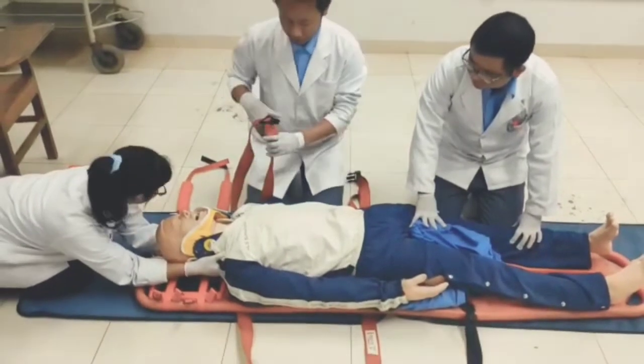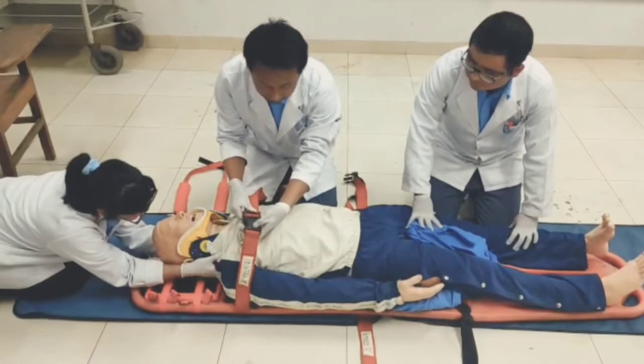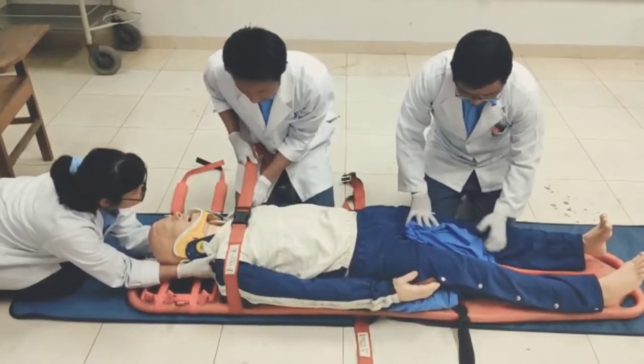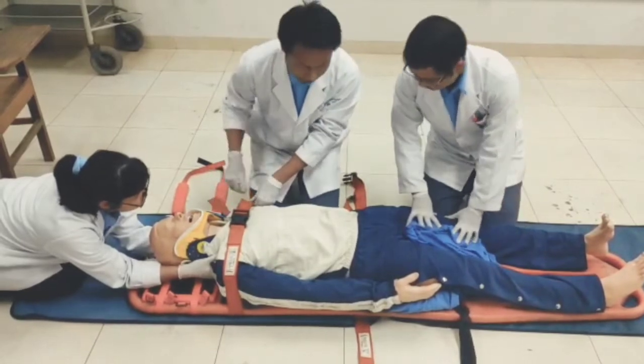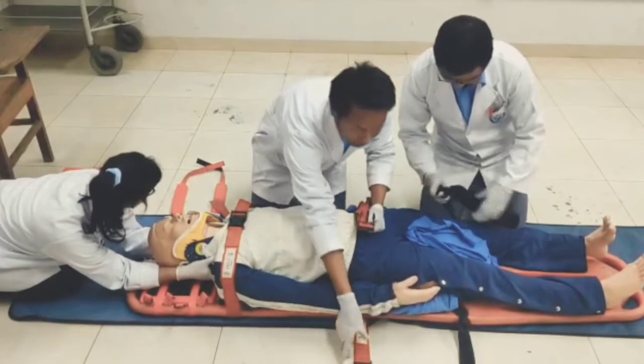First, we will secure the torso. Second, we will secure at the pelvis.